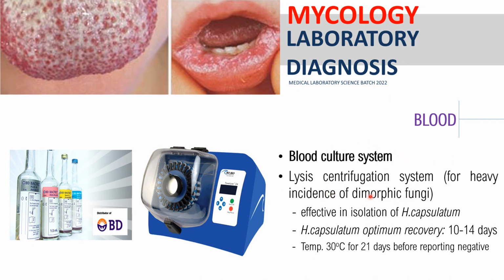Kasi, class, this system is effective in isolation of your Histoplasma capsulatum. Okay, paki-highlight na rin, class, that your Histoplasma capsulatum optimum recovery is 10 to 14 days. So, ano ibig sabihin nito, class? Na kung magkukulture ka using your blood, dapat you will extend your culture up to 14 days. Kasi yung H. capsulatum optimum recovery is 10 to 14 days.